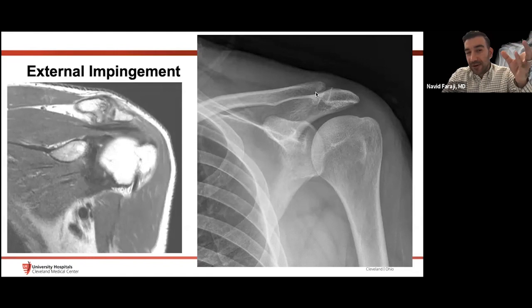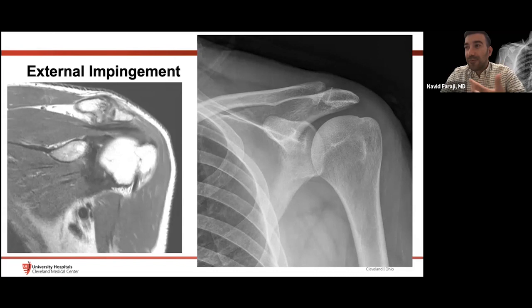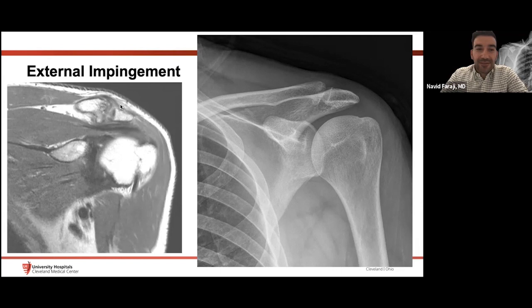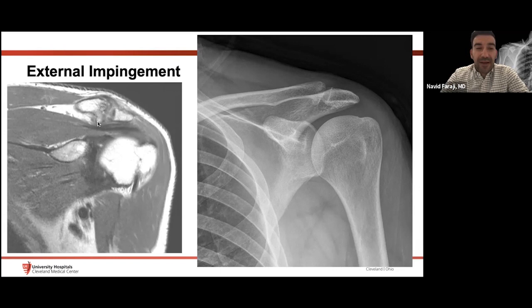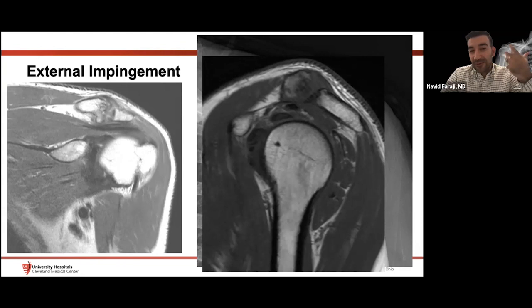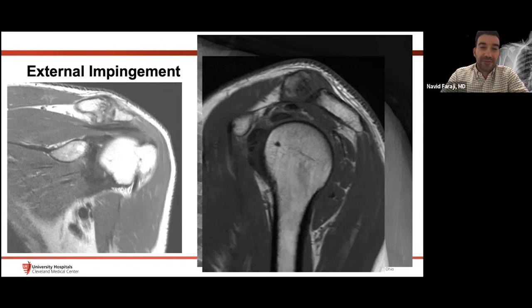For external impingement, MRI and radiography complement each other. On radiograph we can see inferiorly projecting distal clavicular osteophytes from AC joint degeneration, with bowing of the supraspinatus tendon inferiorly due to mass effect. On the sagittal plane, loss of the subacromial fat plane underlying the AC joint is a key finding I look for when suggesting external impingement. Remember it's a syndrome — we can't diagnose it definitively, but we describe morphologic findings that correlate with clinical examination.